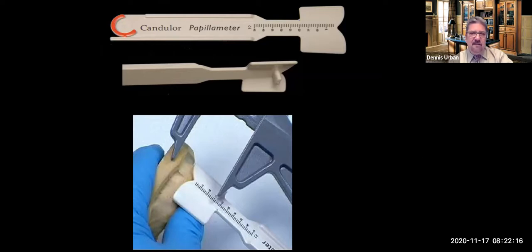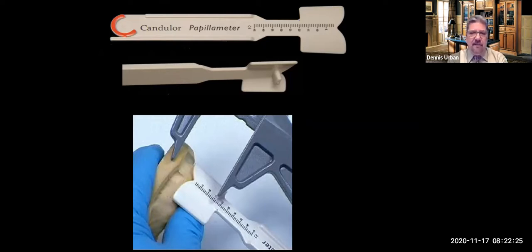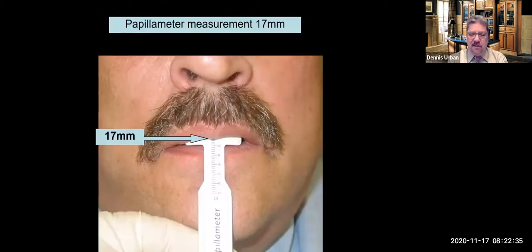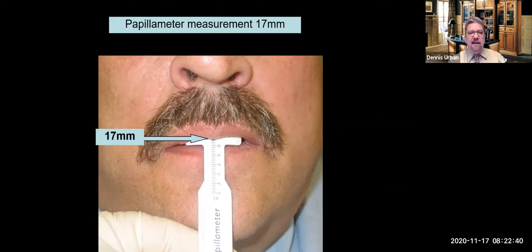One tool I recommend is the papillometer. When we receive final impressions, it enables us to contour the bite rim for you, saving time otherwise spent cutting back or adding wax to the occlusal rim. You place it on the papilla — for example, with the mouth closed, a reading of about 17 millimeters means we'll add a few millimeters to determine where the incisal edge ends up. Here's a short video with Dr. Frank Locelli, formerly with Ivoclar, demonstrating this tool.